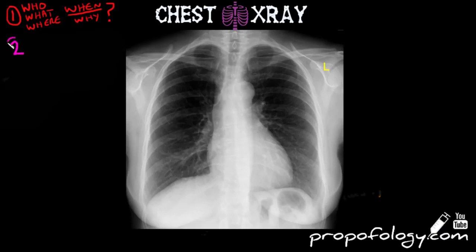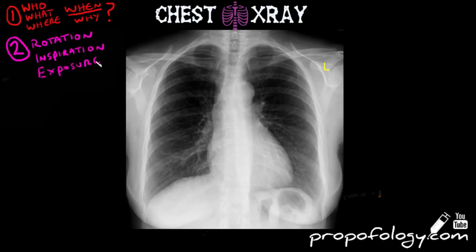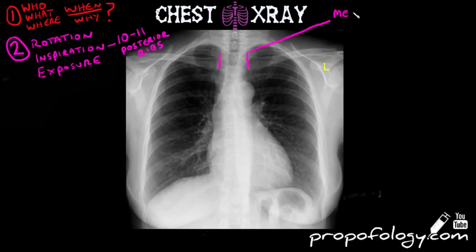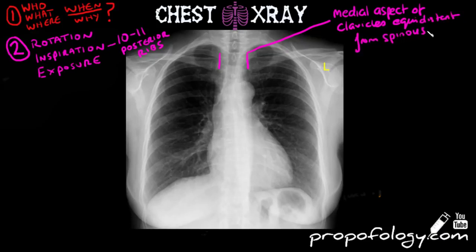Next you should look at the aspects that affect the quality of any given chest x-ray. Rotation: are the medial ends of the clavicles equidistant from the spinous processes? Inspiration: is it adequately inspired? Are 10 to 11 posterior ribs seen in each lung field? And how is it exposed — is it too bright, too dark, and can you see everything that you need to see?